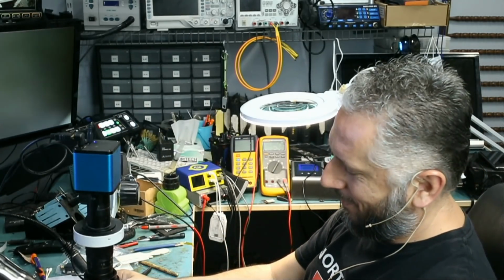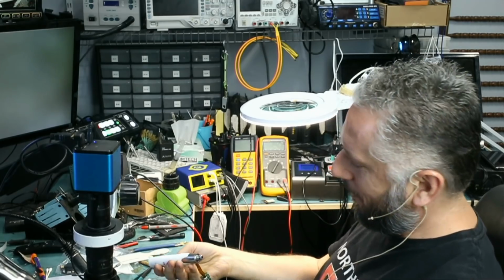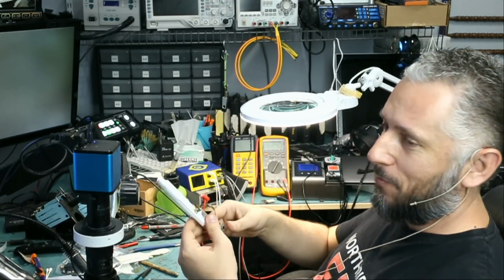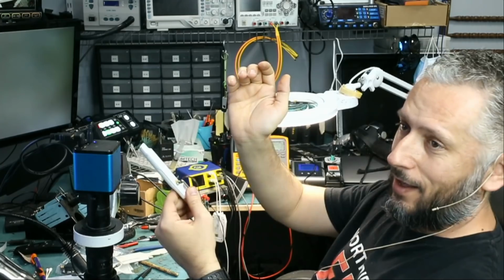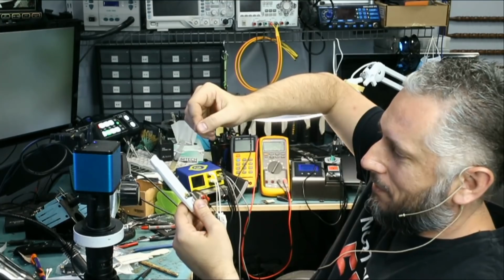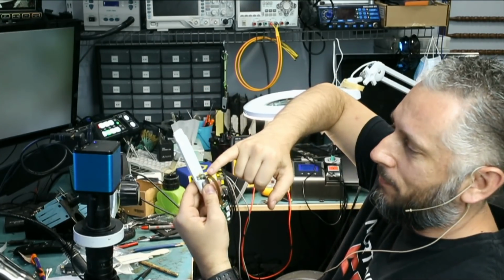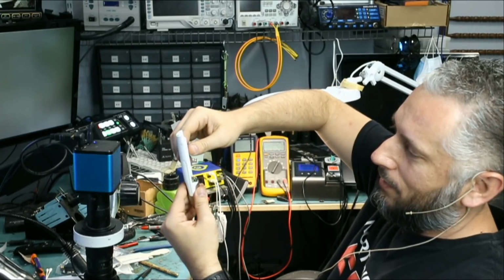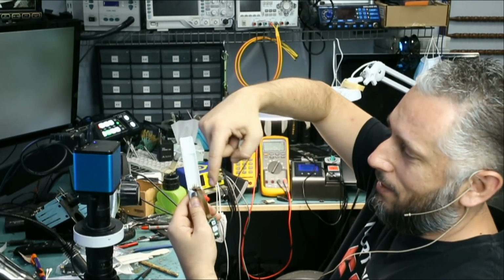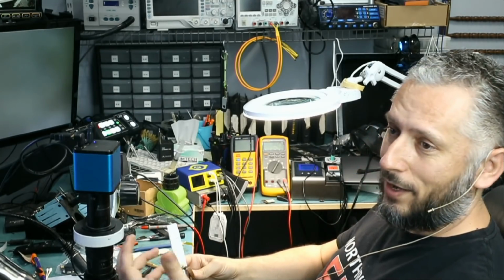Whew. I do not know why I felt like this repair was difficult. I mean, literally, I'm working on it like this, and I cannot rest my wrist on the bench, so I'm going like this. And we have to be careful not to touch the flex cable, because the flex cable goes under the board, and we have to make sure not to touch the plastic also. We have a groove here. We did it, the job is done, and we're gonna end the video right here.